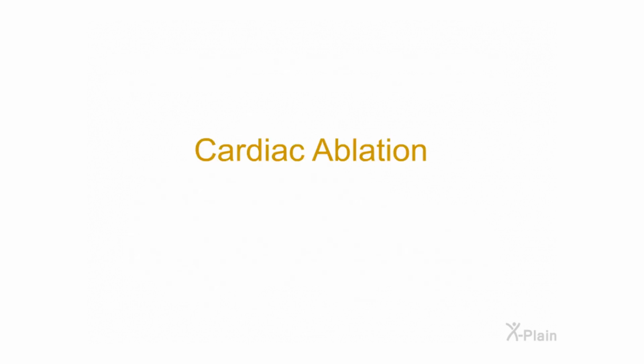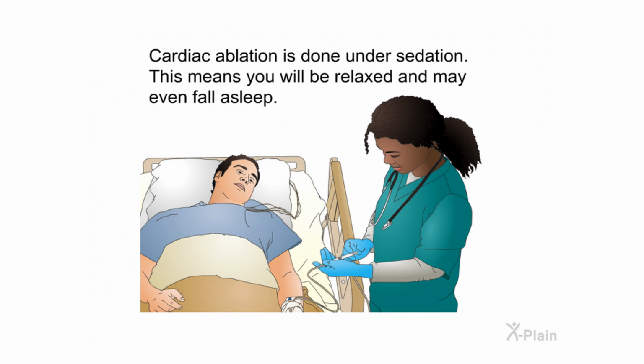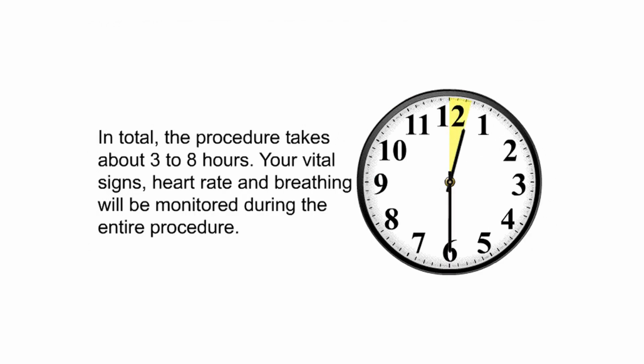Cardiac ablation. Cardiac ablation is done under sedation. This means you will be relaxed and may even fall asleep. In total, the procedure takes about 3 to 8 hours. Your vital signs, heart rate, and breathing will be monitored during the entire procedure.